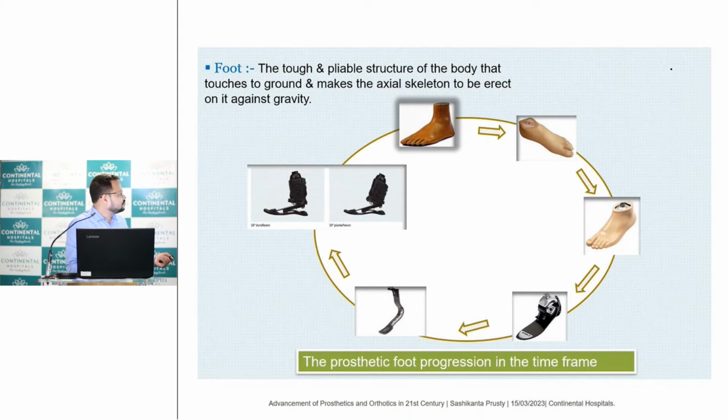So all these options we have. This one is purely for sports activity, this one is particularly for day-to-day life, but we have one in which we can control dorsiflexion and plantarflexion up to 15 degrees. Normally, if somebody is a very fine dancer or something, they need that much dorsiflexion or plantarflexion. But for a normal walking pattern, we don't need this much. So with any normal specific foot that we get, we can have a proper pattern of gait.